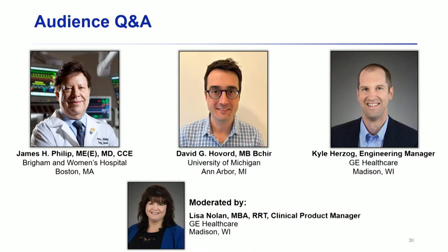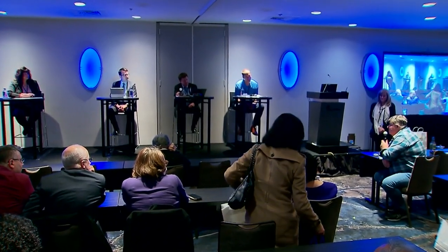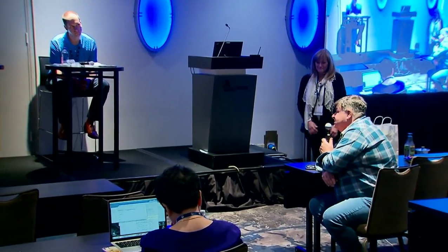Rowan Molnar, former member of Dr. Phillips' department. I've been using end-tidal control almost every day for about 10 years or more in Australia, and I'm a big advocate of it. However, there is one issue that I don't believe has been addressed by the company. By the very nature of what it's trying to achieve, a small leak in the circuit is covered up by increasing the gas flows. Whereas normally we look for our bag or our ventilator emptying out during surgery, detecting a small leak, the end-tidal control system just puts the gas flows up to maximum to compensate for that leak. The first thing I find out about it is looking at the machine, which the end-tidal control takes my attention away from, which is one of the benefits you said. But then when I do look at the machine, it's running at 15 litres a minute and my circuit's full.